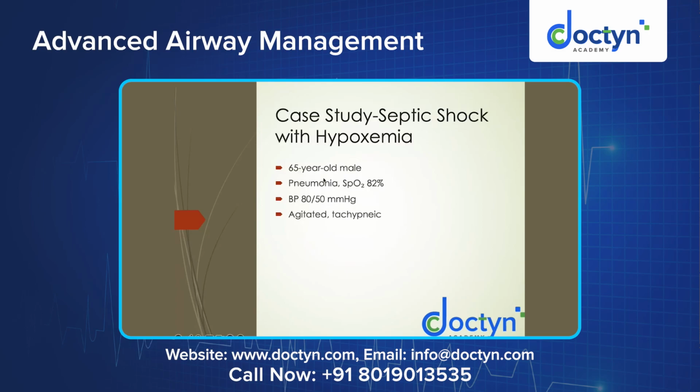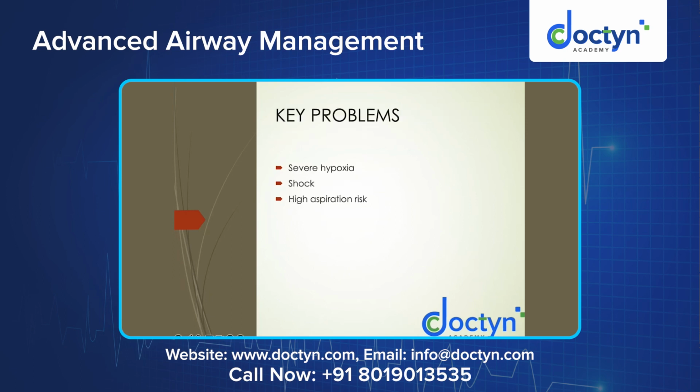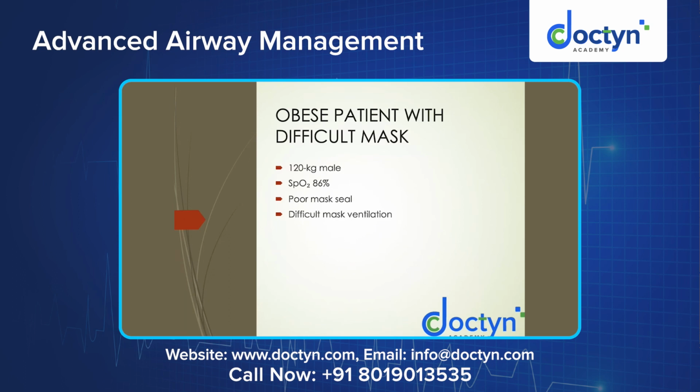He's a 65-year-old male, pneumonia, saturation is 82%, BP is 80/50, agitated and tachypneic. And we have decided to intubate the patient because of severe hypoxia, shock, and risk of aspiration. So what would be the airway plan? As we said, we have to pre-oxygenate, rapid sequence induction, prepare supraglottic airway backup. Choice, ketamine induction. Why ketamine? Because it helps in maintaining the hemodynamics well and allows the patient to get sedated. This also will be discussed in the later sessions of airway management. The drugs, rocuronium paralysis. Go ahead for intubation.